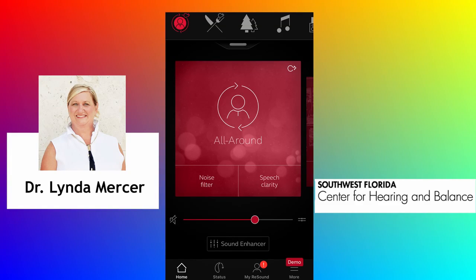So before jumping to conclusions about the hearing aid or the app, determine if your app is indeed in demo mode. You will see the word demo in a red square at the bottom right-hand corner of your screen. You may or may not also notice features and programs you didn't remember having on your app before.